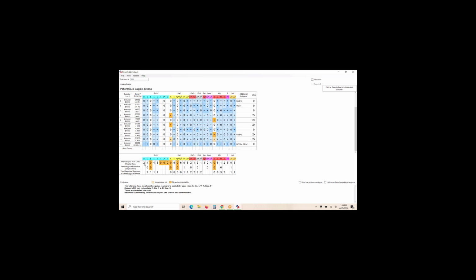And then as far as the rest of exclusions go, if it's in the first 2 rows here, homozygous rule outs, that's your double dose, and heterozygous rule outs, your single dose. If it's allowed, those are going to be where you see your numbers, what you can exclude. And the bottom, remember, this bottom is just to help you, or if your lab allows exclusion by heterozygous donors, in those particular single dose cases.